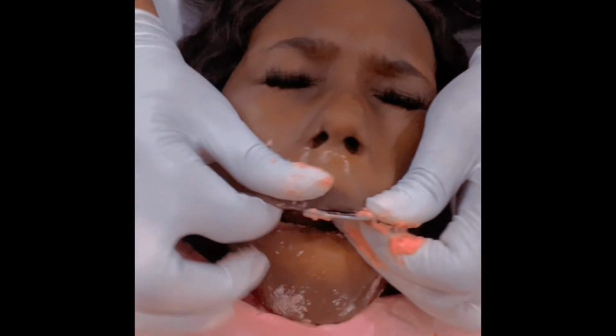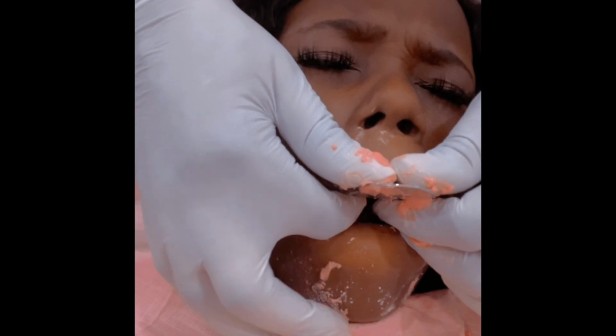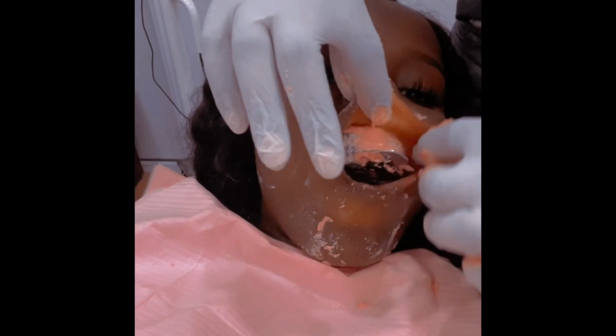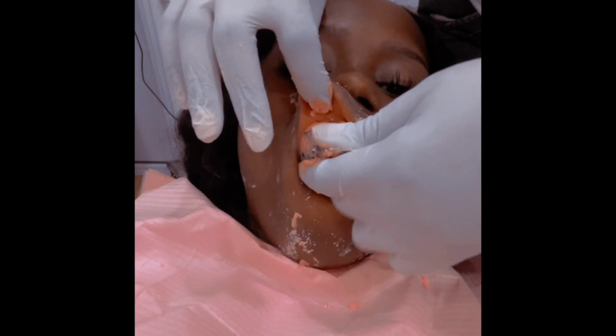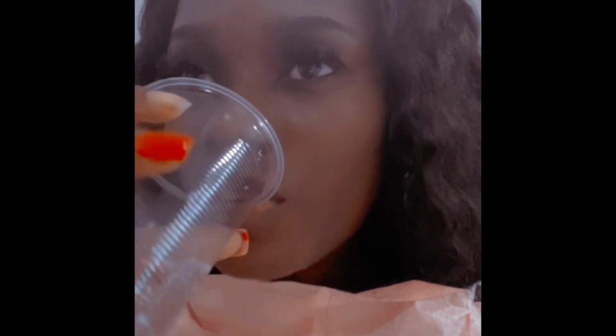Oh god, this was not funny at all. I literally struggled just to hold on to it for some minutes, not even up to 2 minutes. Then they take it out. It lets them know the size of your teeth and the number and everything, so it's just like a proper measurement. Then you can just go on and wash off. It doesn't take much to come out. It's just like normal glue. It comes off easily once you clean off, and this is the result of it.